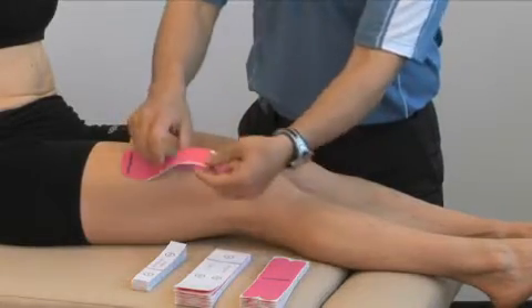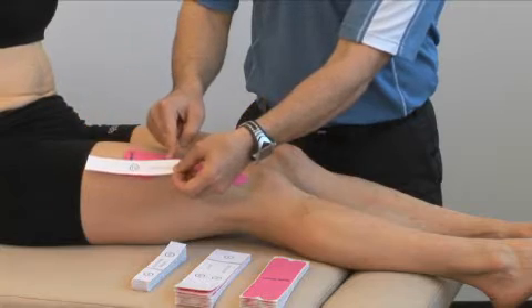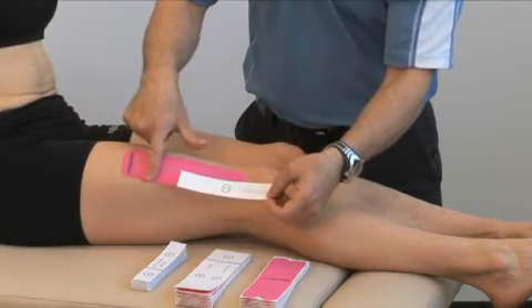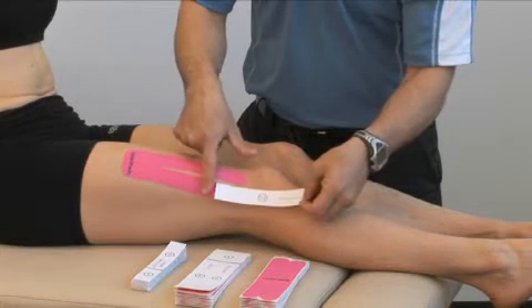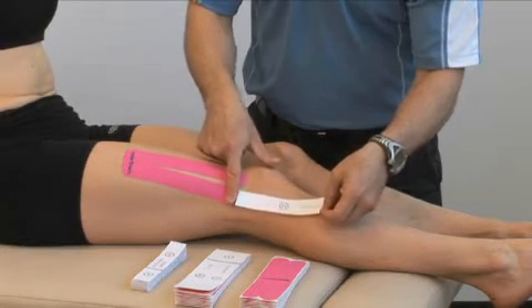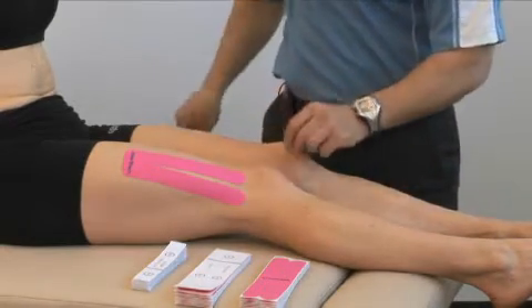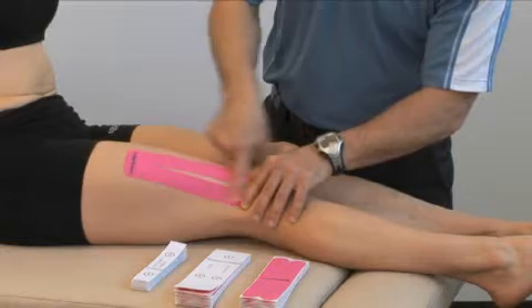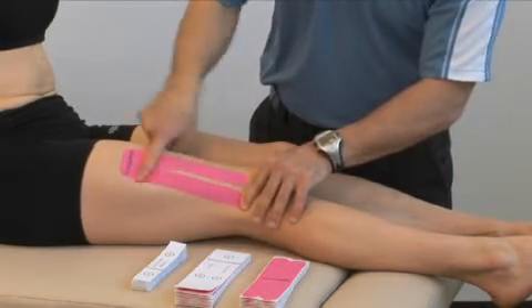The same for the other projection: peel the backing away from the tape, gently lay the tape down in contact with the skin letting your finger follow behind, waiting till about 90% is applied, and then remove the backing completely. Rub over top of the tape to activate the glue.